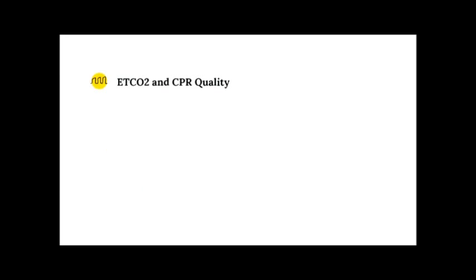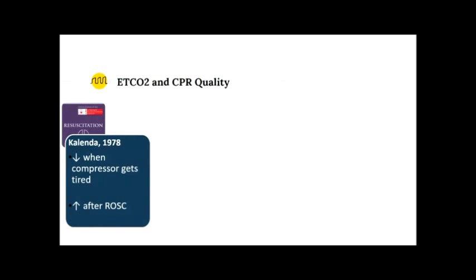So with end-tidal and CPR quality, the Kalenda group in the late 70s were the first to report the association between CO2 and CPR. They noticed in 3 cardiac arrest patients they were studying that as a compressor got tired, the patient's CO2 began to decline. And this formed a bit of the basis of routinely switching out our compressors. They also noticed that as ROSC was achieved, there was a significant increase in the CO2 value.